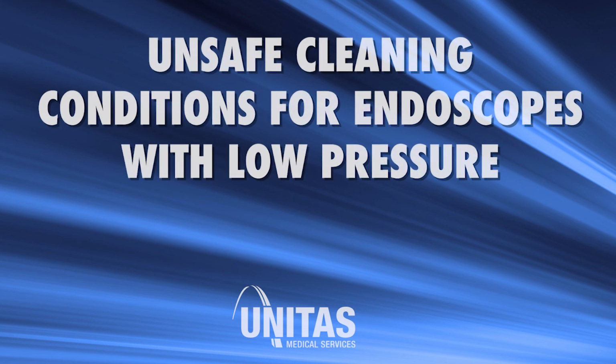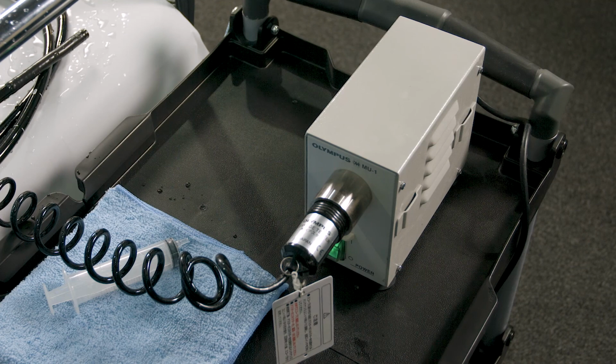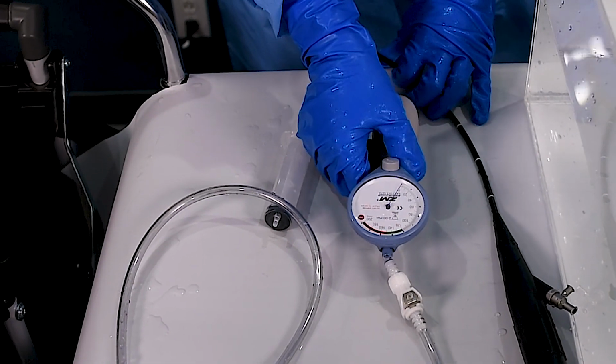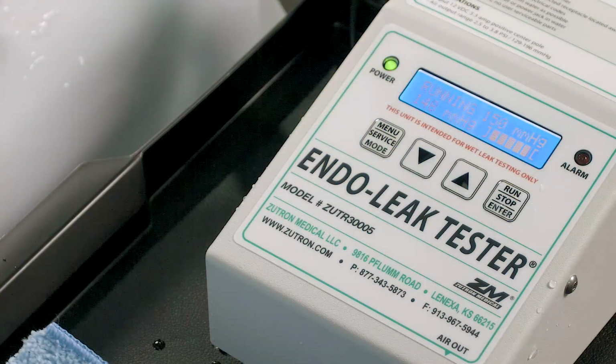Unsafe cleaning conditions for endoscopes with low pressure. Always confirm that the established required pressure is able to be maintained on the leaking endoscope during the decontamination process. This mostly occurs from a large cut, torn, or disconnected channel, open control bodies, or if using a handheld leak tester versus electric.